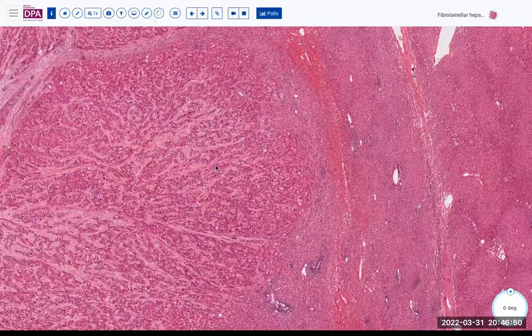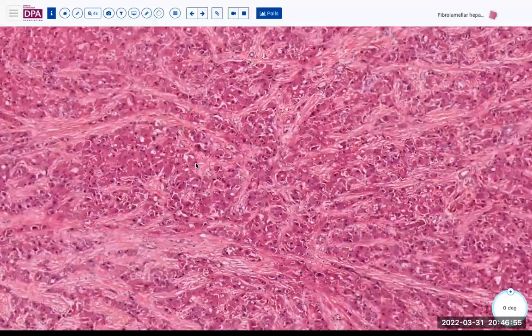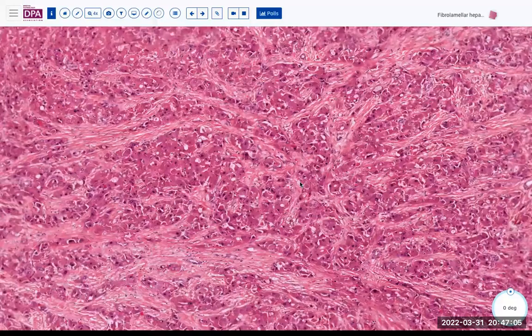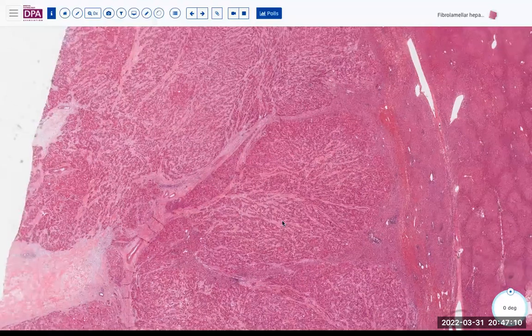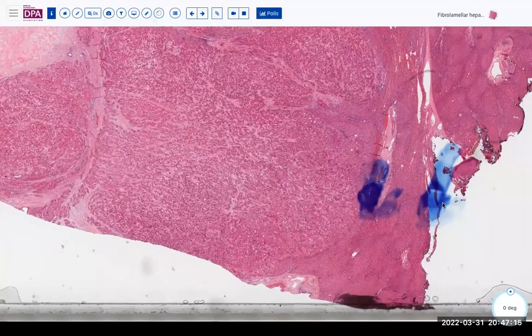Here is our fibrolamellar tumor, very eosinophilic cells, the sclerosis here in between, as we've indicated. So a nice overall example of this lesion with fairly sharp margins and been resected here. This was the partial hepatectomy, leaving here a little margin. This was the closest margin.